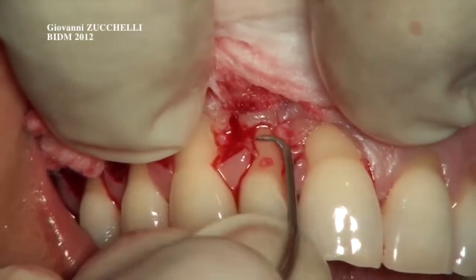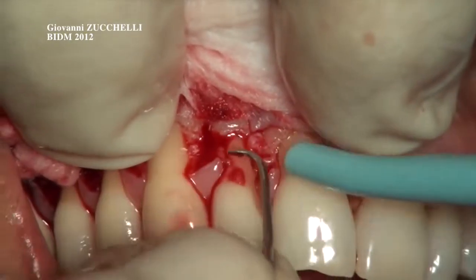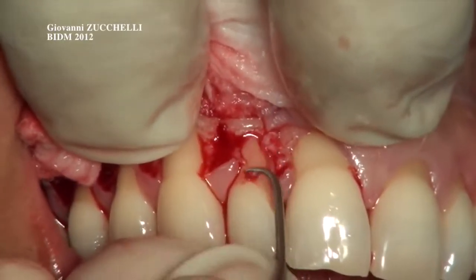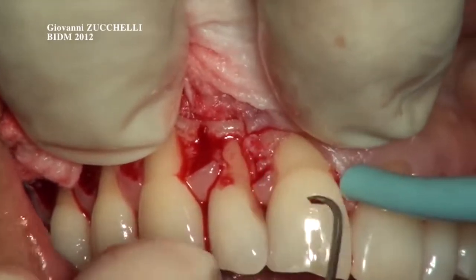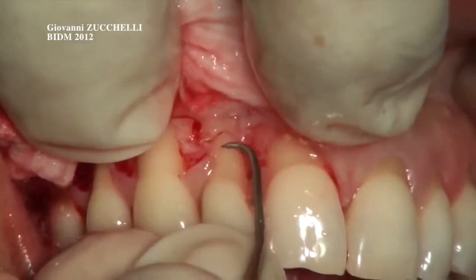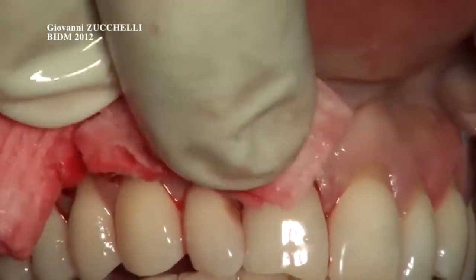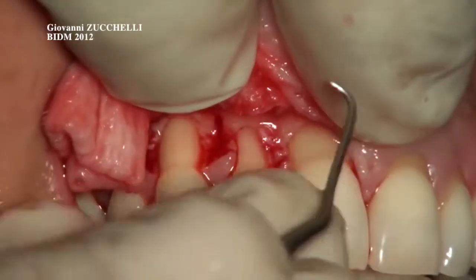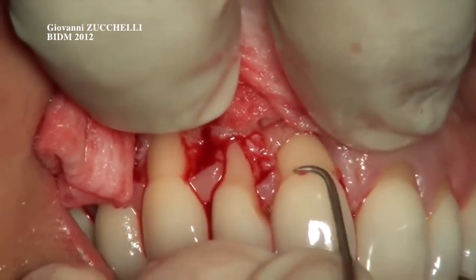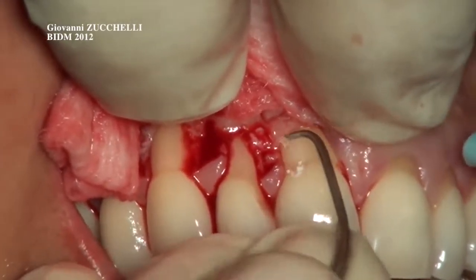Don't suction there, just remove. The reason why I always use saline during the surgical procedure is not to permit the assistant to suction on my soft tissue, and to always leave hydration of the soft tissue. Now I'm going to, with the gauze, expose that area of the central incisors that has to be root planed here, with saline.